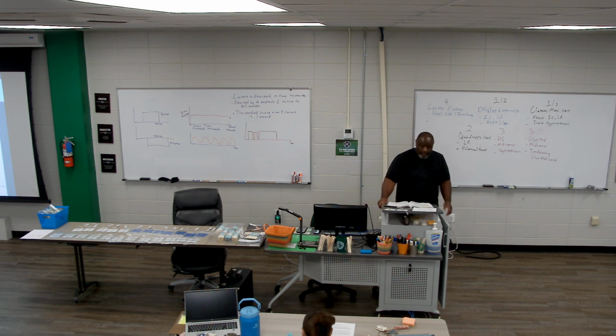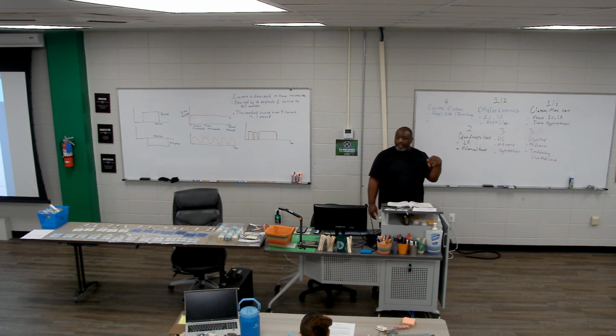That's sensory. Motor is when now I start to get movement out of stimulating that peripheral nerve. Now it's starting to cause active movement to occur. And then finally, the third one is pain. I can turn it up so high that I can start to cause you pain.